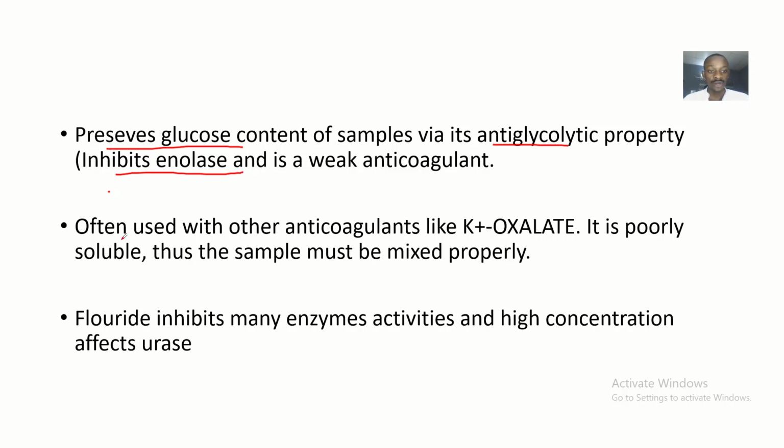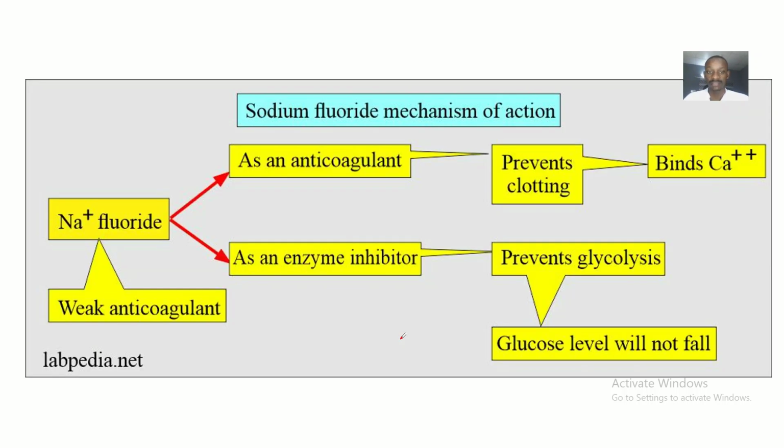Okay. So it is often used together with other anticoagulants because it's a weak one. All right. Like potassium oxalate. All right. So it is poorly soluble, so the sample must be mixed properly. So if you are putting sodium fluoride in a blood sample, then you need to mix, okay? So fluoride inhibits many enzyme activities and high concentration affects urease, okay?